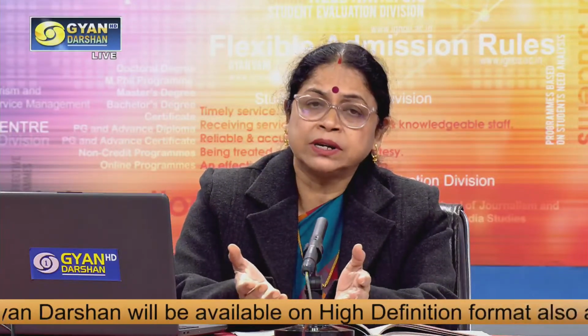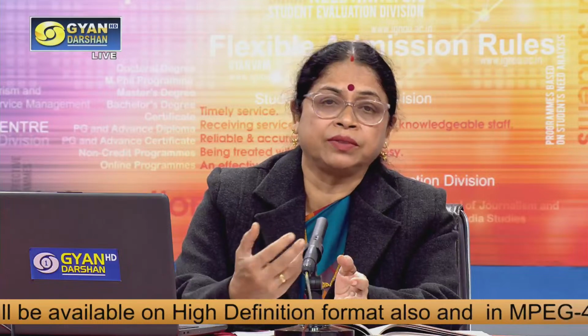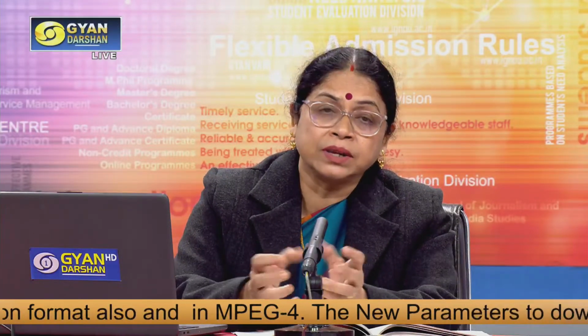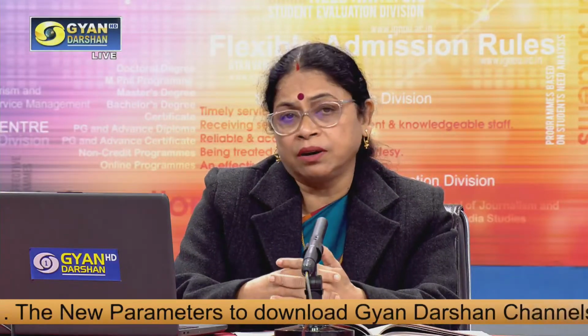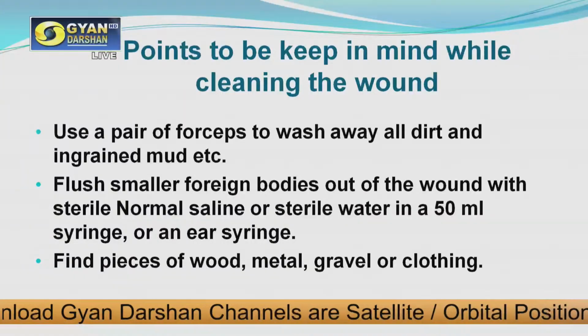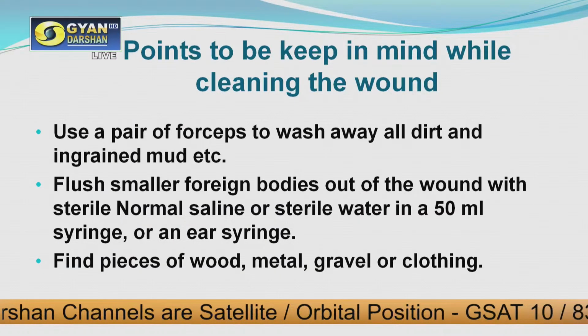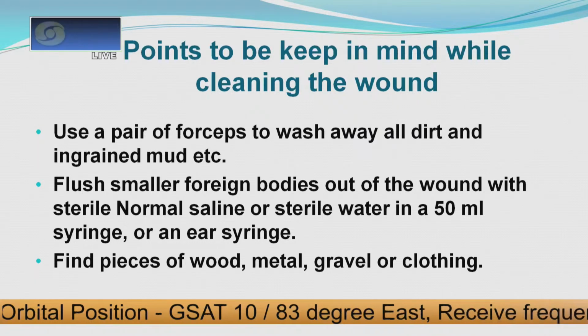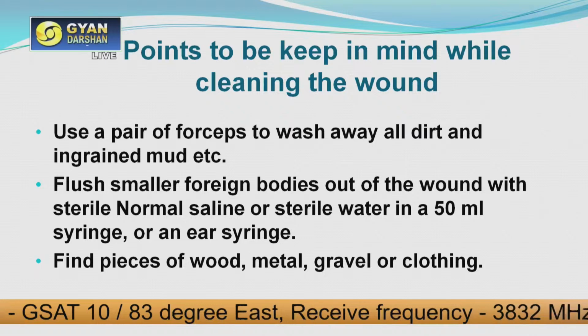Use a pair of forceps to wash away all dirt and ingrained mud. If the patient comes in with any condition, if there is mud or dirt or whatsoever in the wound, you have to clean it, depending upon the condition of the wound. Then you flush smaller foreign bodies, if there is any foreign body in the wound, with sterile normal saline. This is the best solution, and you should use sterile only.